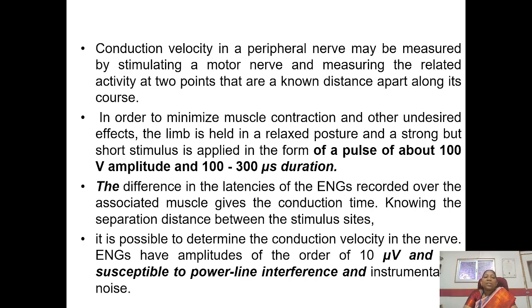The distance between the index finger and the wrist is measured, and the time taken between giving the stimulus and getting the response is also measured.